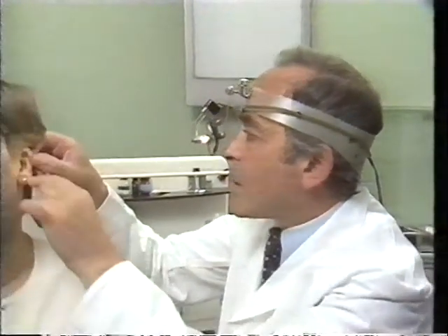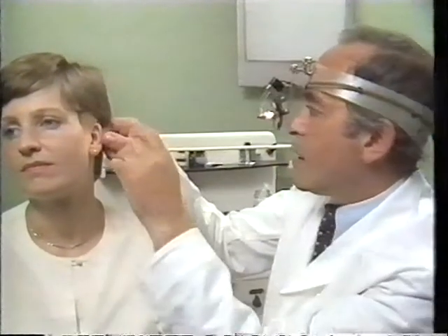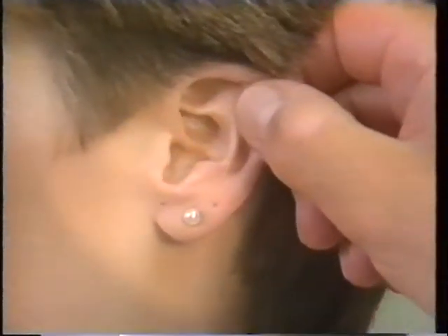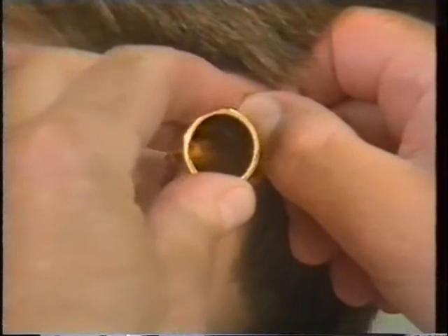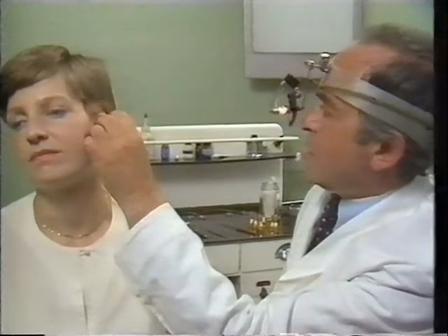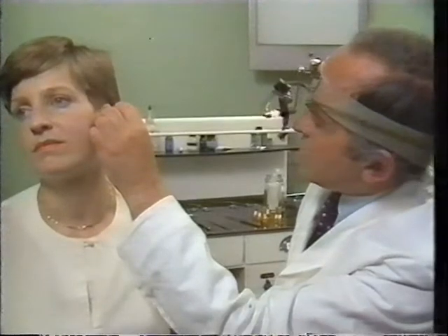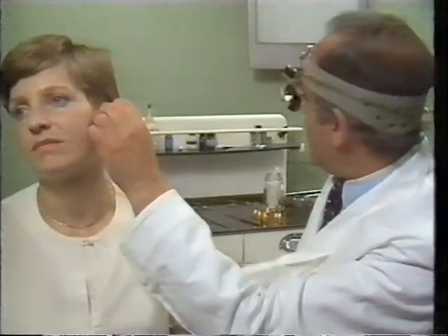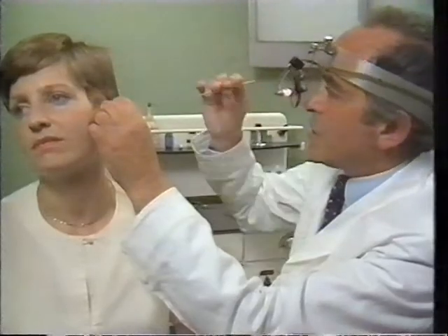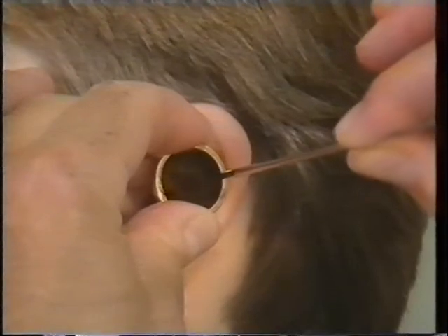The pinna is inspected for abnormalities and surgical incisions, and then the pinna is drawn upwards and backwards to straighten the external ear canal and an aural speculum inserted. This allows inspection of the meatus and gives a good view of the tympanic membrane, in many ways better than the one achieved with the magnification of an otoscope, since the depth of field is greater and the open speculum allows the insertion of instruments for the removal of wax or the mopping out of secretions and discharge.